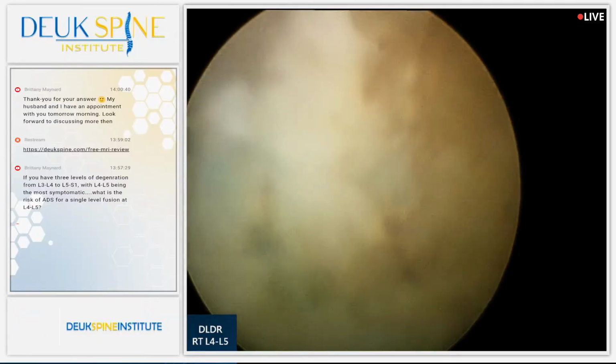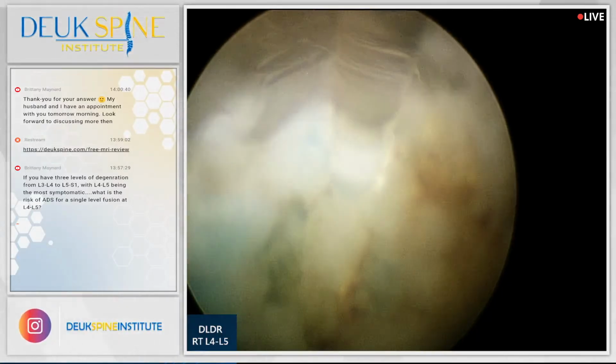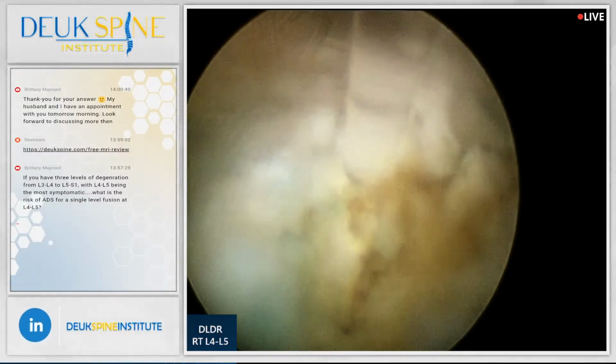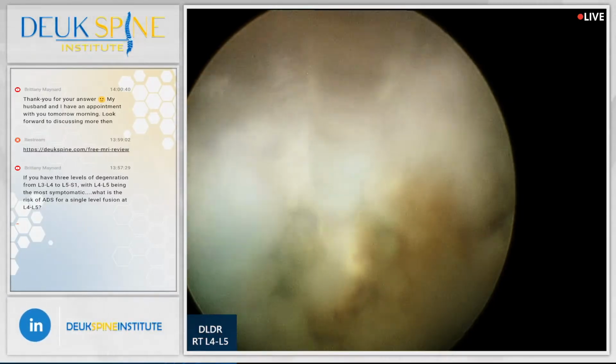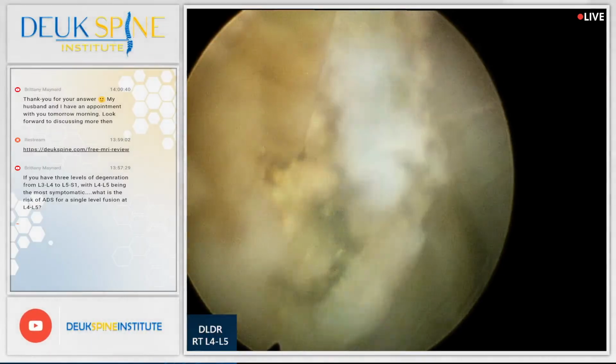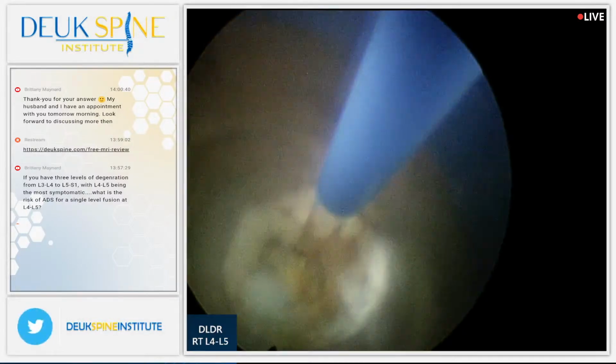And basically that glass, you see where it ends right there at the tip? That's where the laser energy is released from, right there at the tip. It doesn't come off the sides, it comes out of the tip. We call this a straight firing laser because it fires straight. The energy comes out straight, which is what I like.